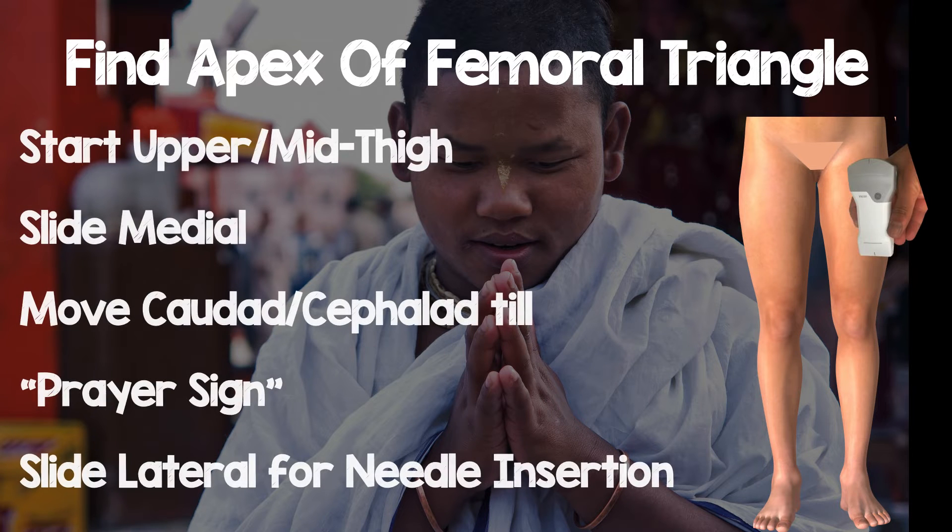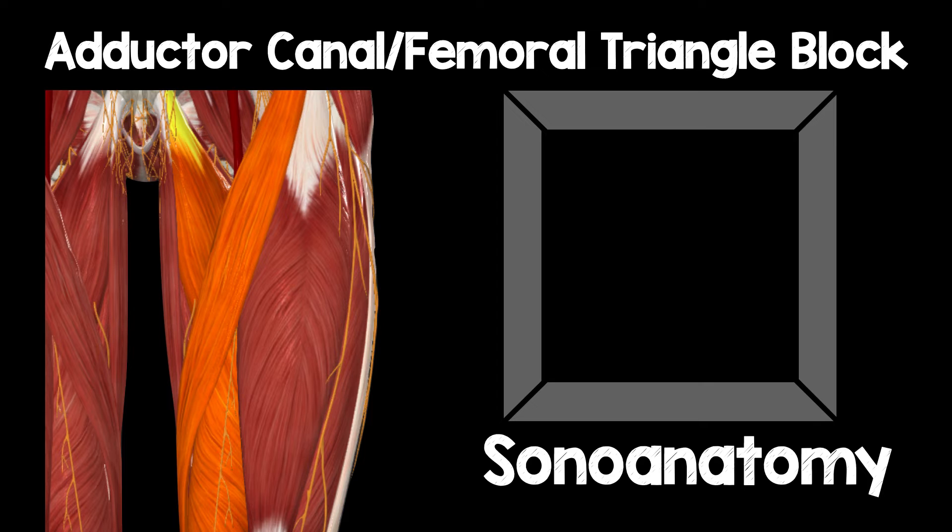To find the apex of the femoral triangle, I recommend starting on the upper or mid thigh, slide the probe medial and move caudad and cephalad until you identify the prayer sign — I'll come back to that. Once you've identified that prayer sign, which is a surrogate for the apex of the femoral triangle, you then slide your probe lateral for needle insertion.